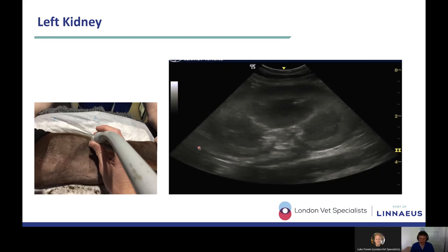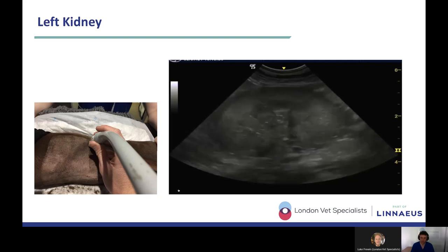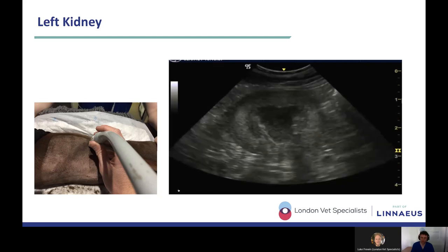In dogs, it's a bit more tricky to judge renal size. If we're going to try and be objective about it, we can compare the renal length to the thickness of the aorta, and it's usually 5.5 to 9.1 times the thickness or the width of the aorta at the level of the renal artery. But this is a nice sagittal view of the kidney, and it looks absolutely normal. So that's me with the probe fixed, very subtle movements, maybe a little bit of fanning, and now I'm fanning dorsally and ventrally, and now I've rotated my probe, so I've got a short axis view of this left kidney. Rotated my probe around 90 degrees, so this is now a short axis. Again, it's got cortex, we've got medulla, nice corticomedullary definition, and we've got the renal pelvis here. This would be the view that you'd use if you were measuring the size of the renal pelvis.